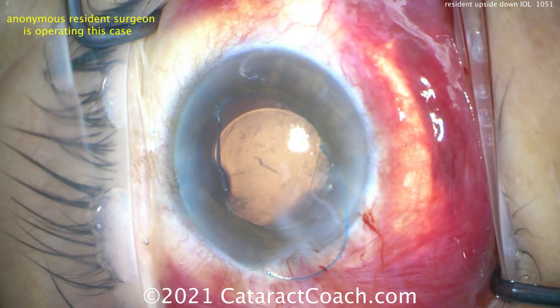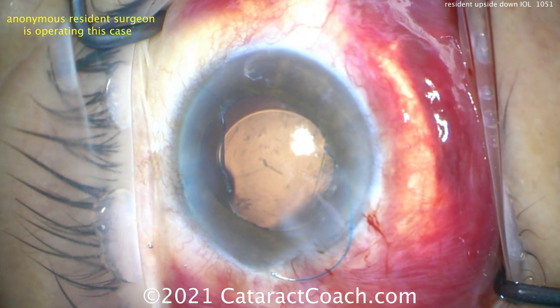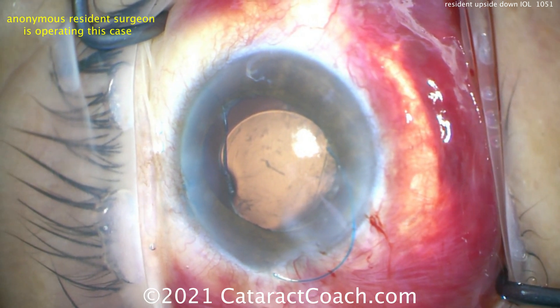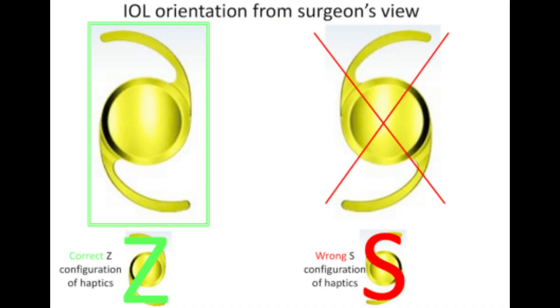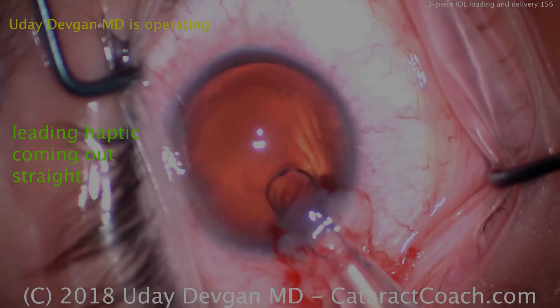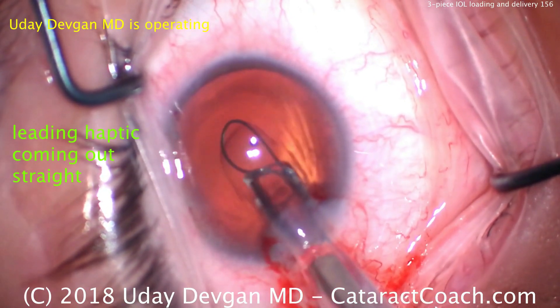So you need to get the lens flipped back around. The refractive outcome can change as well — this is just not a good situation. If you see this S configuration, you have to know it's upside down and flip it. Let me show you the correct orientation — it looks like a Z configuration. The S is for stupid mistake, and we all make stupid mistakes.